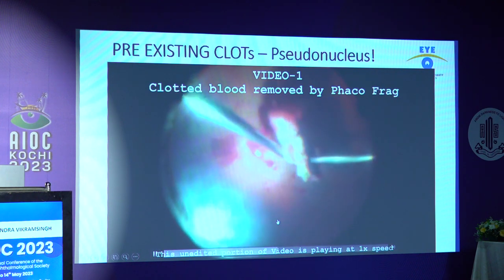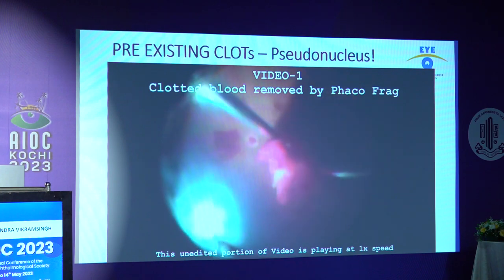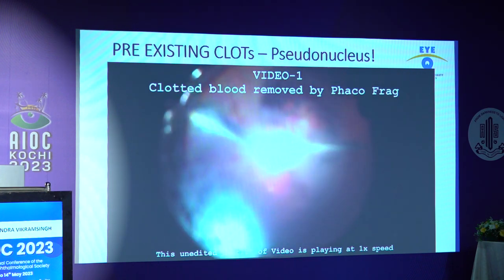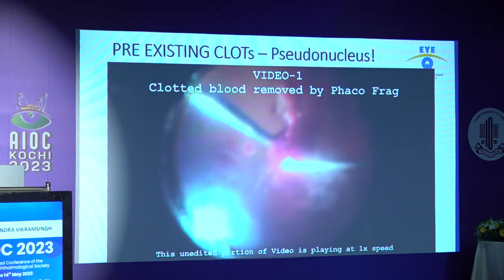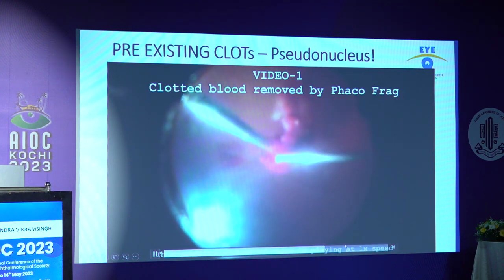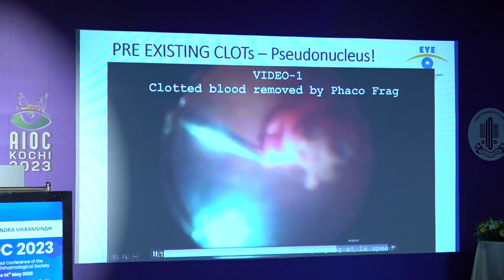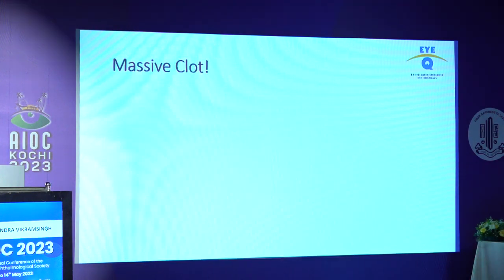This is just to share an idea which Dr. Reddy gave us maybe 6-7 years back. We were struggling with a big clot in the OT, and then he said, why not use a fragmatome? We have shown in that publication that it was over in just 30-40 seconds, and it was a huge nucleus-like clot. So this is one small tip for all.